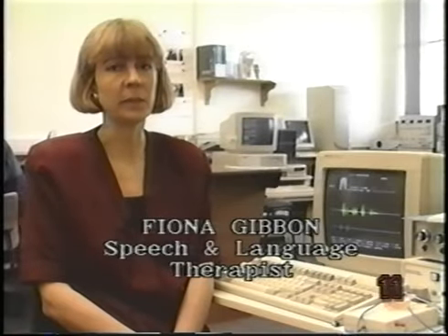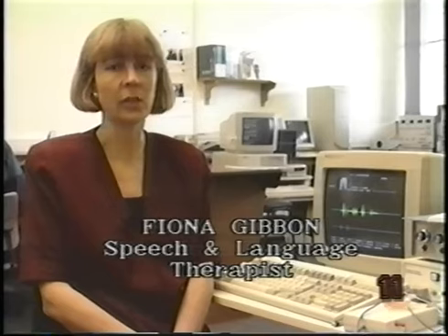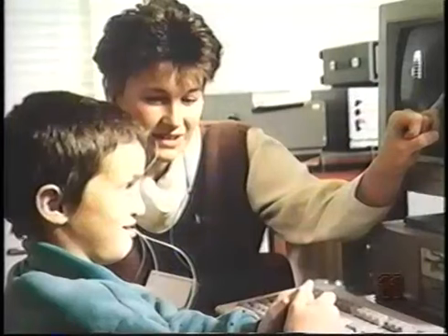EPG is proving to be a valuable clinical tool for assessing and treating a wide range of speech disorders. The technique can provide details of tongue movements that aren't always obvious from an auditory analysis. Peter was aged 9.5 years when he was referred for EPG therapy.